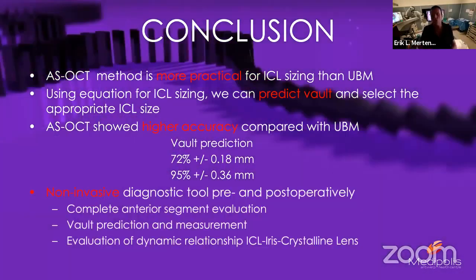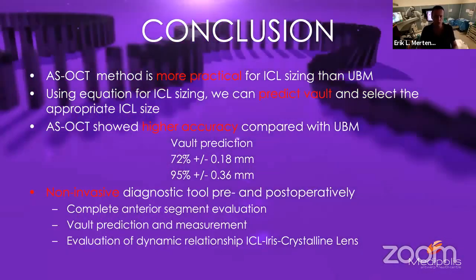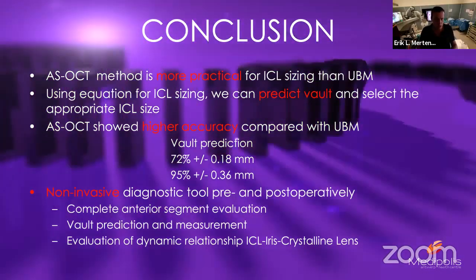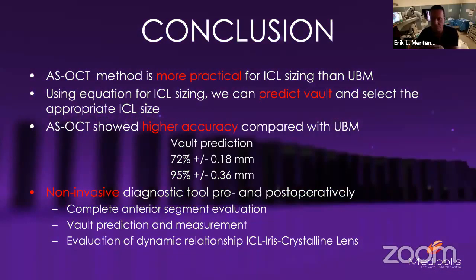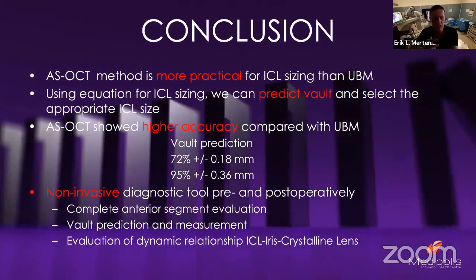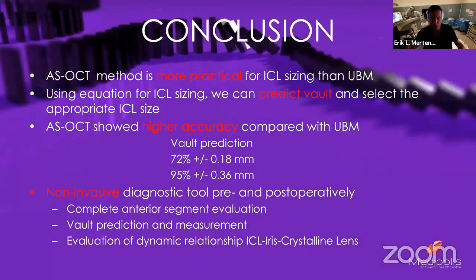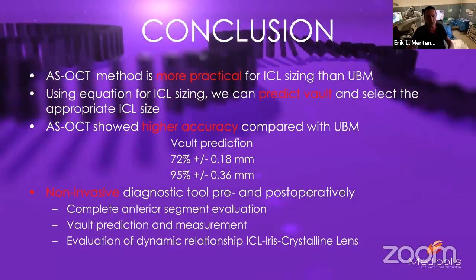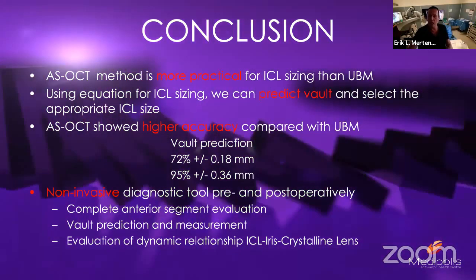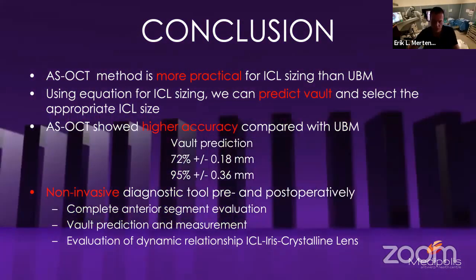And actually this is a non-invasive tool, pre-operatively and also post-operatively, to see whether everything is going well. It gives you a complete anterior segment evaluation. It can very nicely predict the vault size and the measurement, which diameter, of course, to implant. And it can evaluate post-surgery the dynamic relationship between the ICL, the iris, and the crystalline lens.